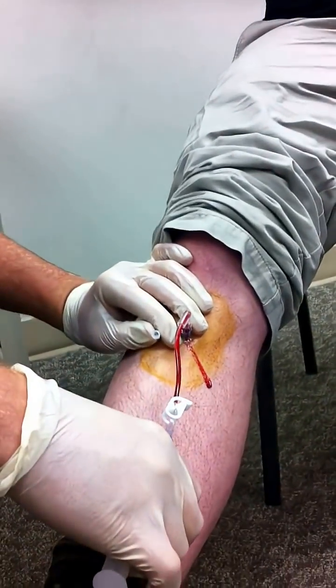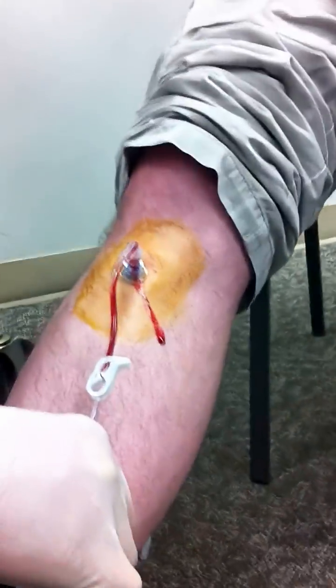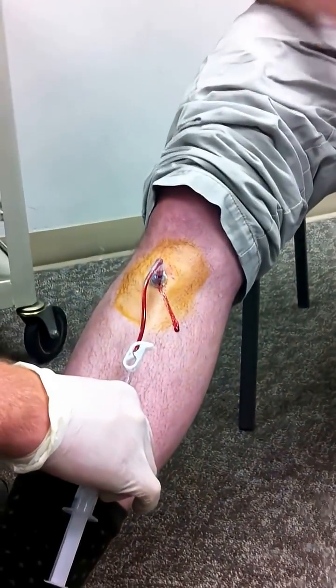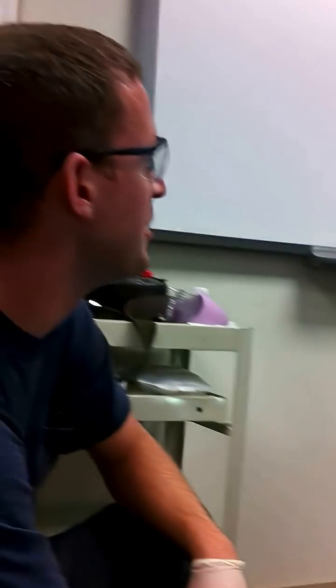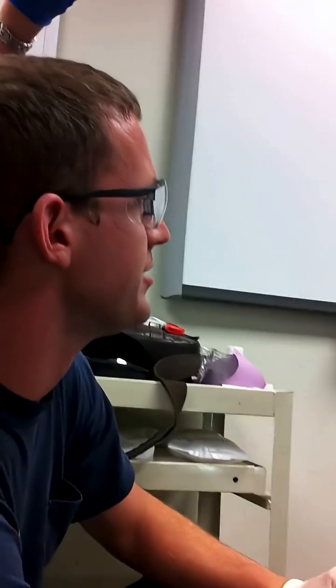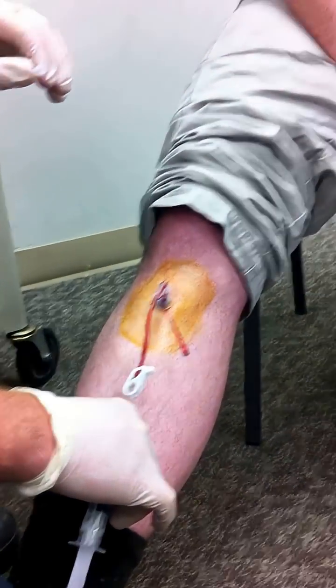Actually guys, like I said, it's more of an achy pain. Really, it's a very dull pain experience. It's intense, but — I would say, from judging this, you have very good bone density in this leg. I have put in IOs that went in much easier and nicer than that. That's good news. Yeah, you're a healthy young individual.